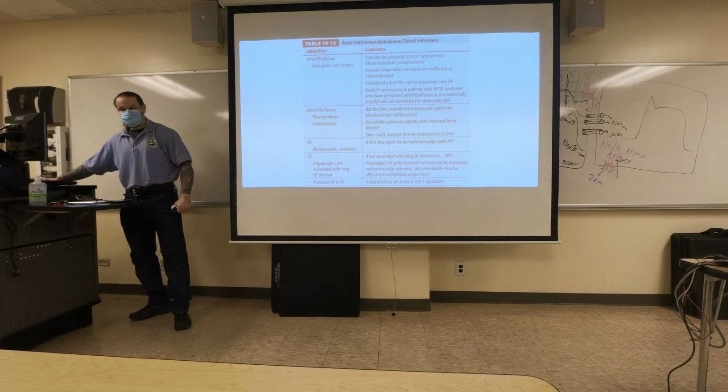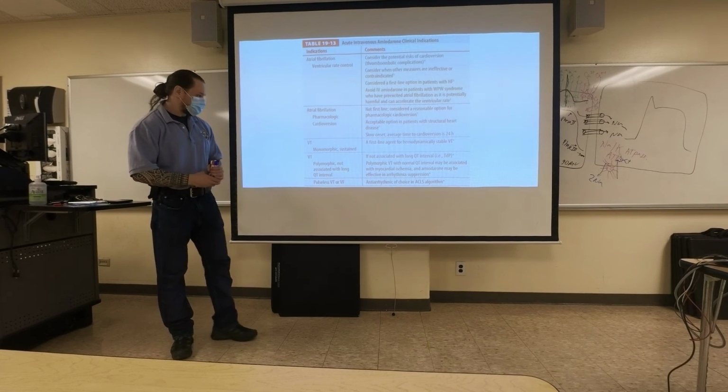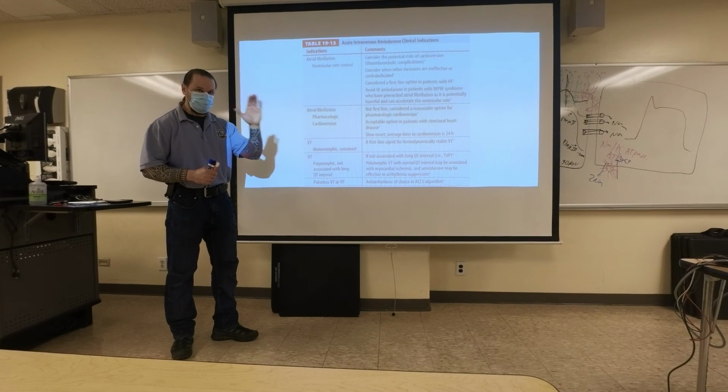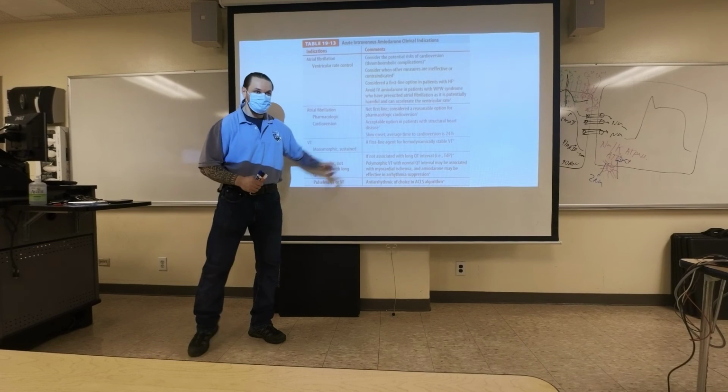Question? So this is all for the sustained V-Tach. What about for that run of V-Tach? Yeah, you can still give it. You're still treating the run, even though it converts back to sinus rhythm, because it can come back, right? And if I see those periods coming in and out, and they're monomorphic in nature, I'm going to give this medicine.